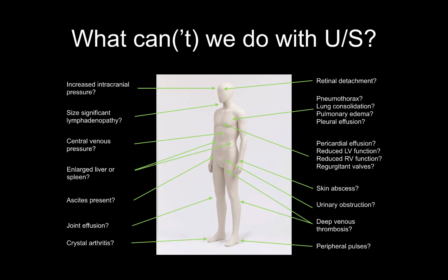This slide illustrates some of the key applications of bedside ultrasound in the field of internal medicine. As you can see, beyond the traditional applications of lung, cardiac, and IVC ultrasound, there's a number of situations where it could be useful to put the probe on to clarify what's going on with the patient. So next time you encounter a diagnostic dilemma, ask yourself, could ultrasound be helpful in this case? In many situations, the answer will be yes.